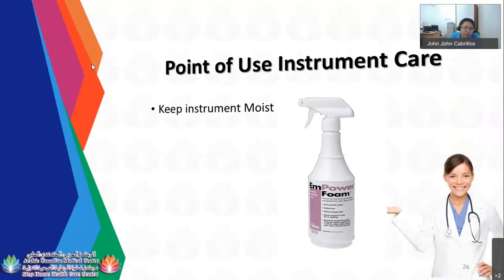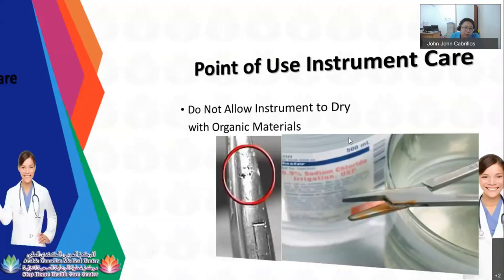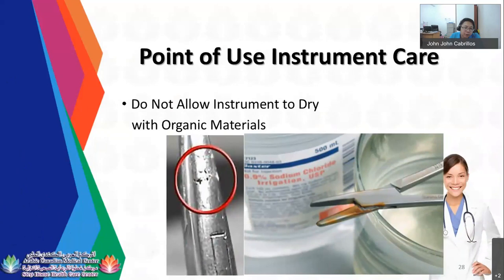And do not allow instruments to dry with organic materials, which means the blood cannot be dried, because it is hard to remove, and it can also damage your instruments. Not only blood, but other organic materials like saline solution, liquids, betadine, should not be dried on the instruments.